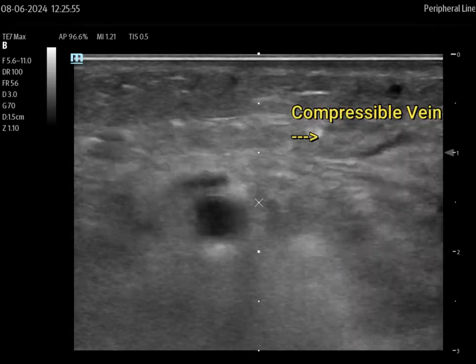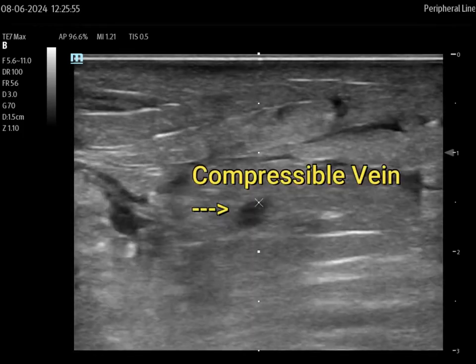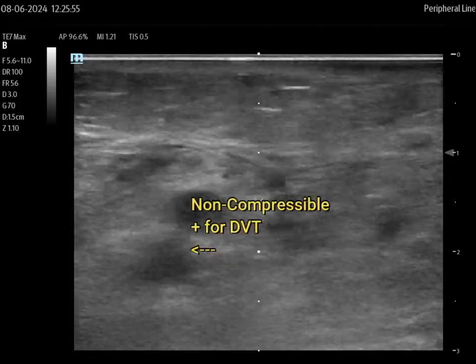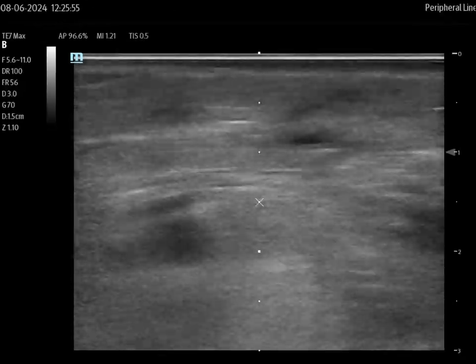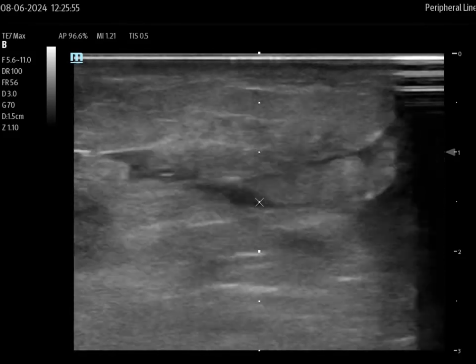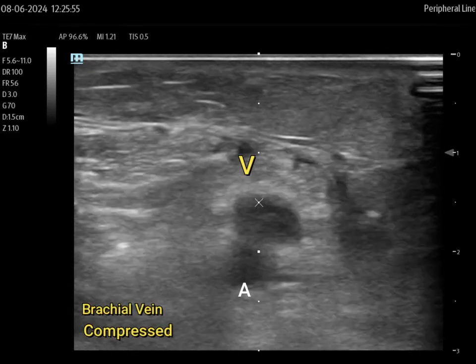The biggest thing you're going to have to understand is when you're looking at a vein, you're going to have to be applying downward force with your ultrasound probe to see: does that vein compress? Is it an artery? Is it a clean vein that has no thrombus present in it? You don't even need color doppler — just apply downward force to get that vein to smush. If the vein is found to be non-compressible, you're going to want to slow down your POCUS exam and focus in on that section.